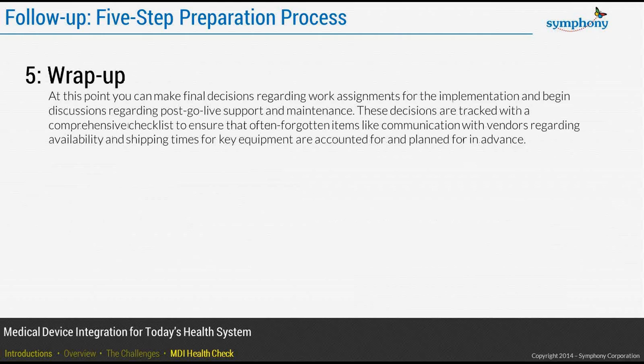And finally, you have a wrap-up. So this is where we're going to double-check our work. We're going to make some final decisions regarding work assignments, which individuals are going to be involved with the team on a regular basis, which ones are backups, and who's not going to be there. You want to talk about your post-go live support, how you want to handle that, and the maintenance. What kind of backup equipment do you want, if any?